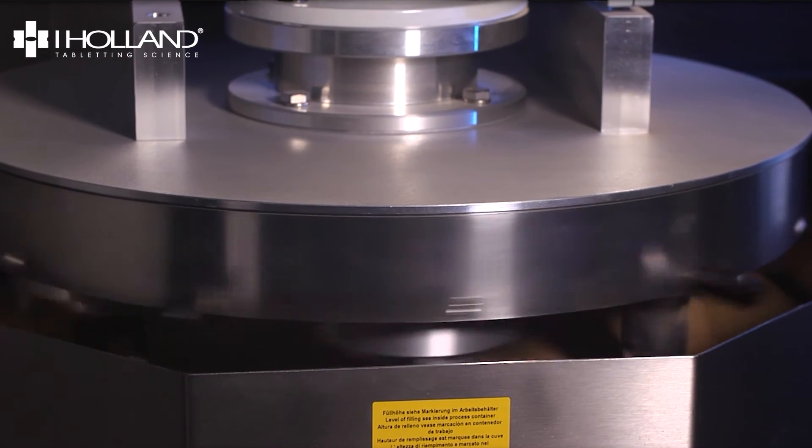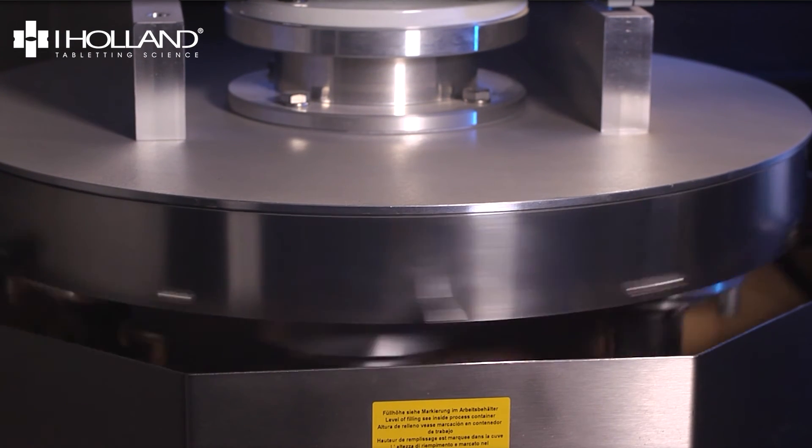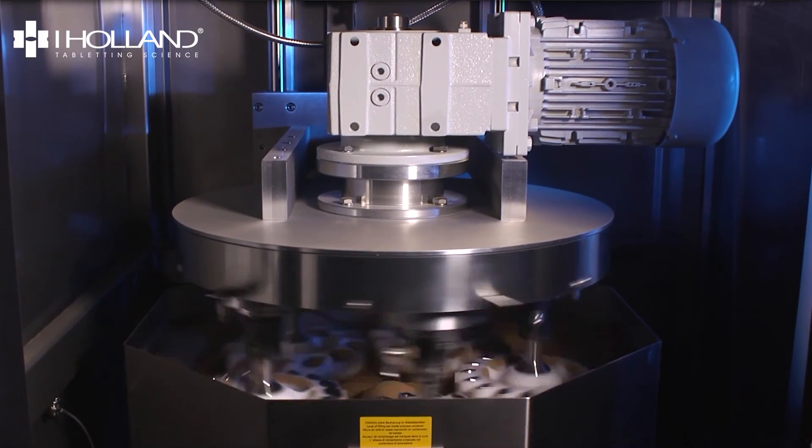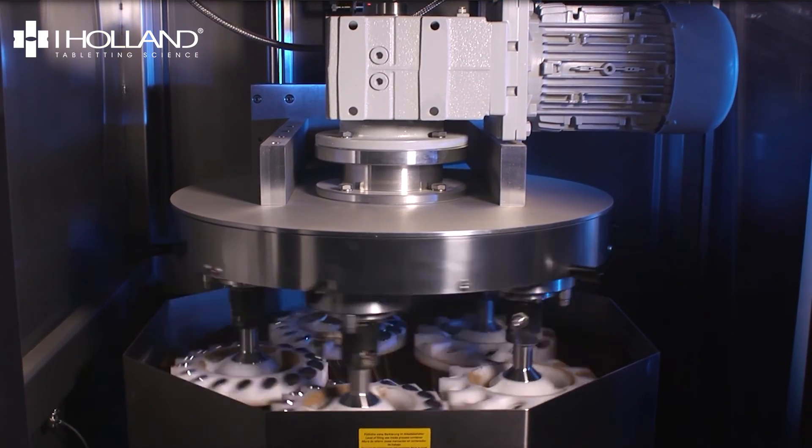The polisher will run for 5 minutes clockwise and then 15 minutes anti-clockwise. When the polishing cycle is finished, the tools will automatically lift, ready for unloading.